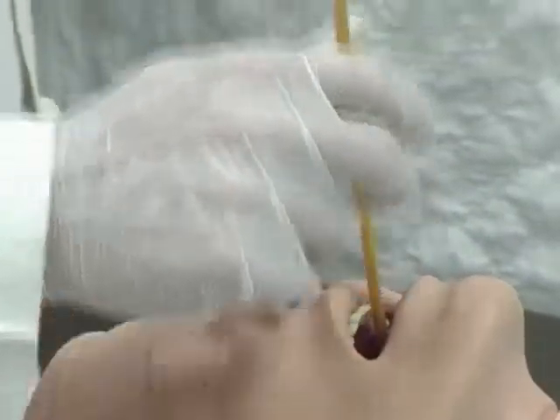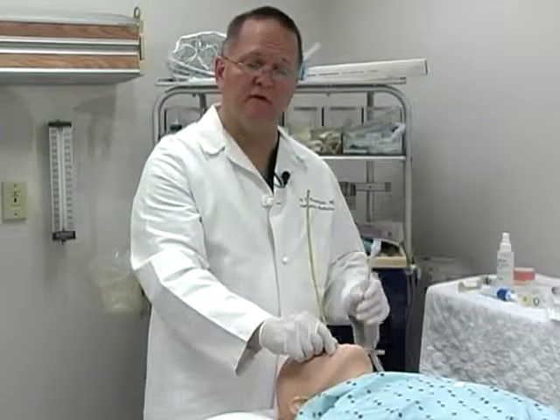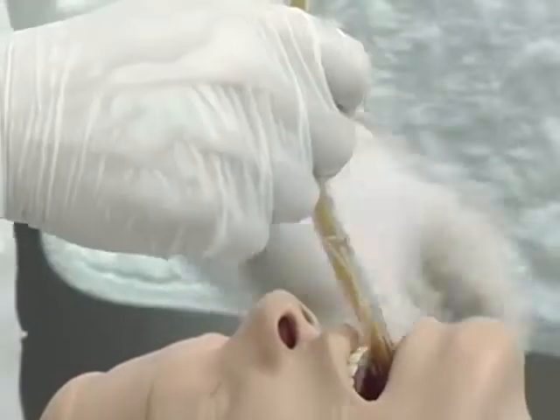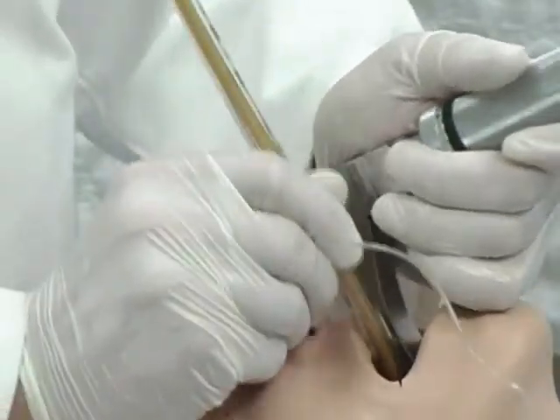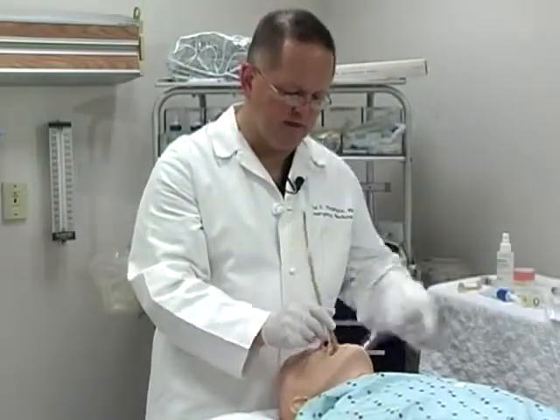Once the bougie is advanced to the point where it stops, which will be resting upon the carina, begin the process of feeding the endotracheal tube down into the trachea using the gum bougie as a guide. To assist in this process, it is often helpful to use the laryngoscope blade to help keep the tongue out of the way.